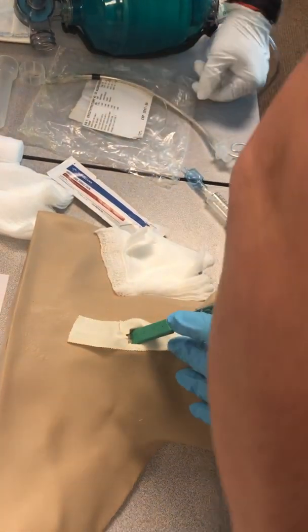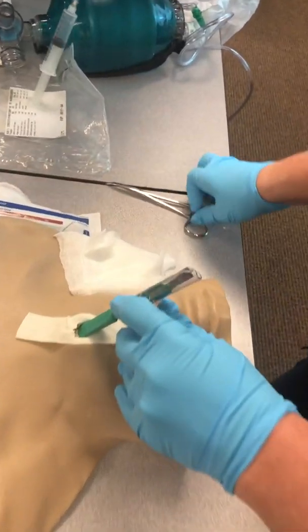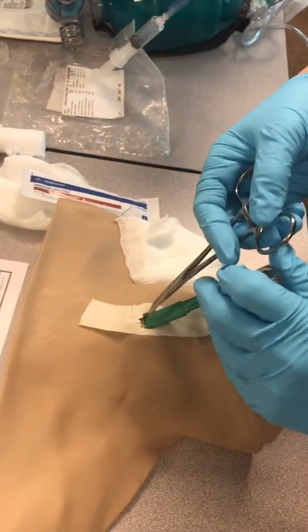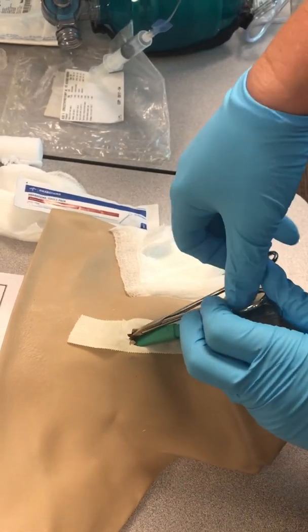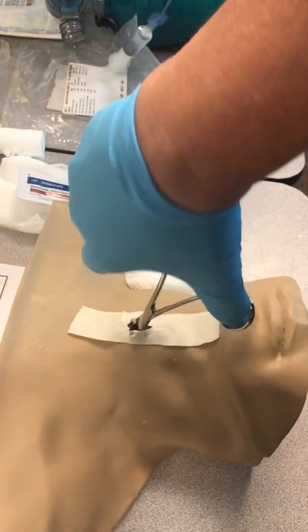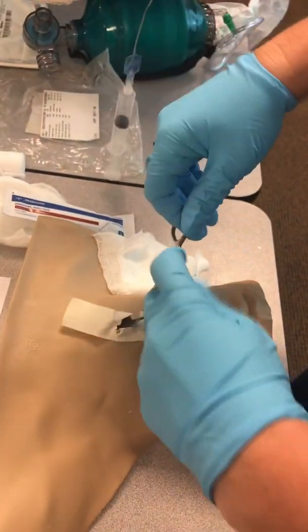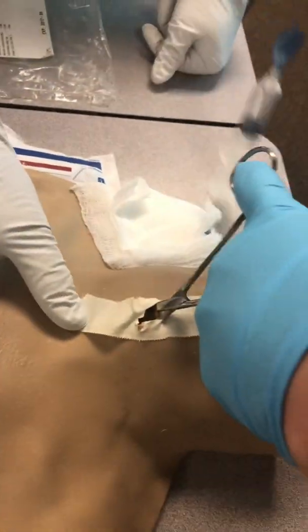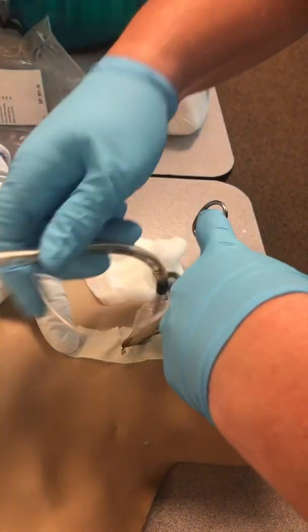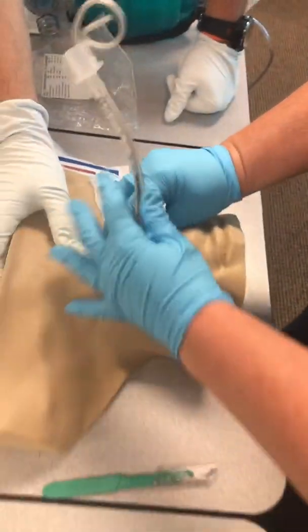You can try to guide the tube through with just that, or slide in your curved forceps to hold the cricothyroid stoma open. She's going to hold the stoma open and introduce the 5.5 ET tube until the cuff passes the opening.